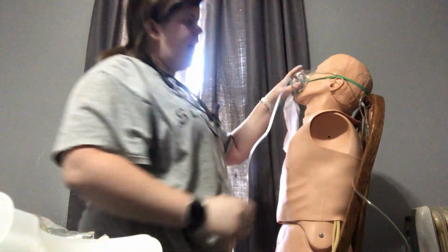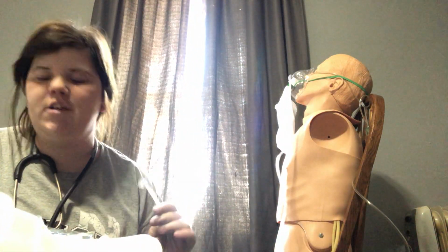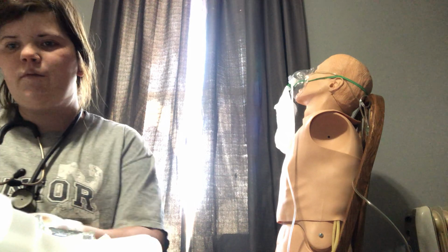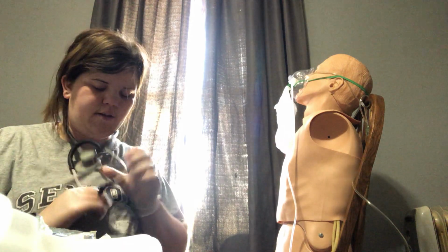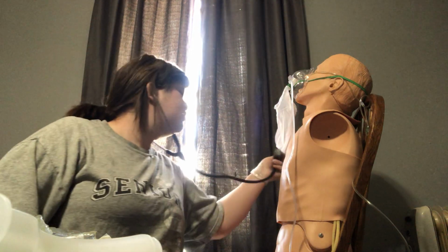And ideally we'd have end-tidal CO2 hooked to either the non-rebreather that we left on him, or magically hooked up. Anywho, we're going to go ahead and check lung sounds again. We're going to assess the patient's level of consciousness and respiratory rate, depth, and effort again.